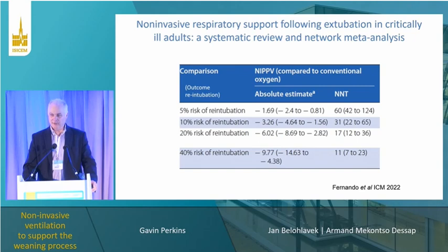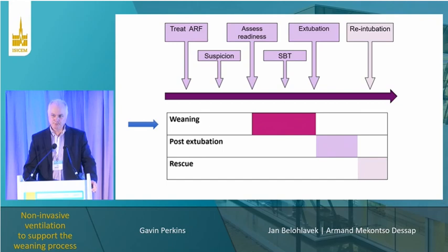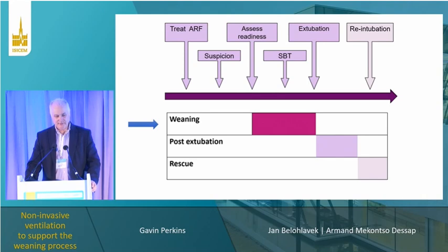So this is the bit where we're going to look at the three different areas where one might apply it in practice. The first is as part of the weaning process. So this is a group of patients that fail the spontaneous breathing trial and they're extubated in order to then receive non-invasive ventilation. And I'll touch on that before looking at its use as post-extubation preemptive treatment and then rescue therapy.